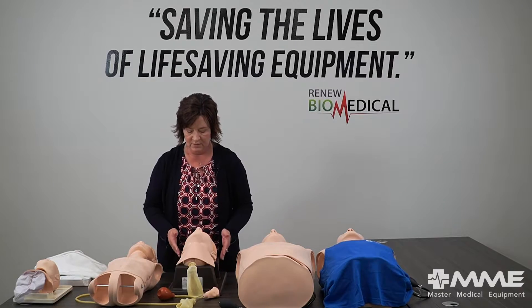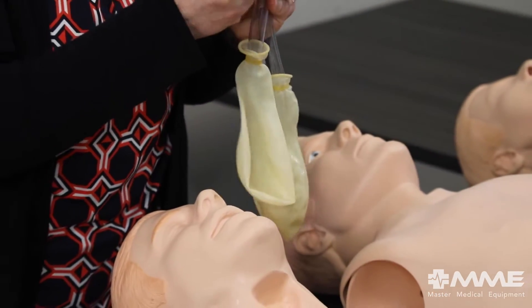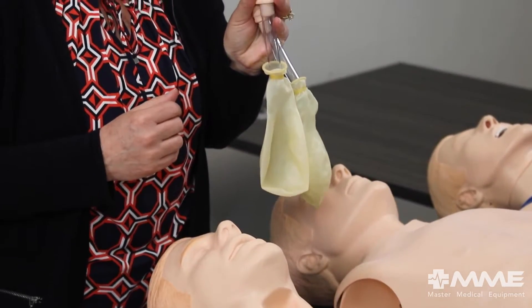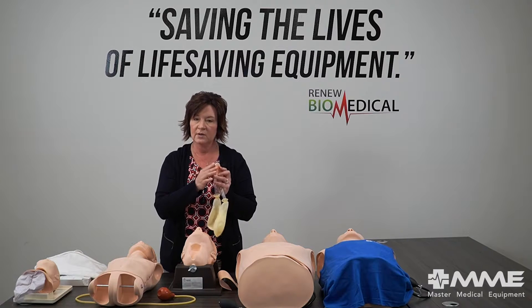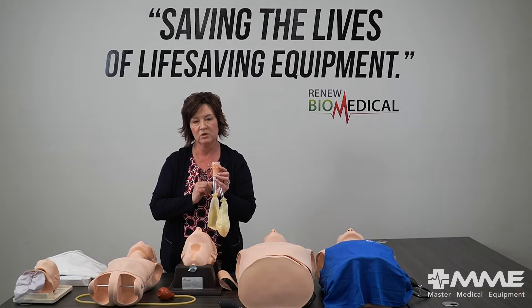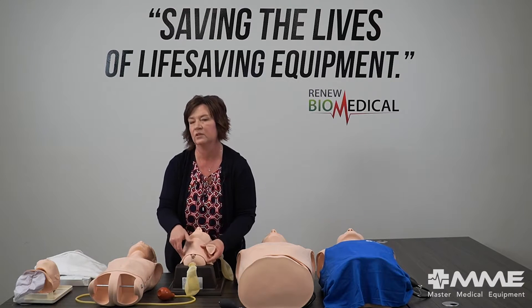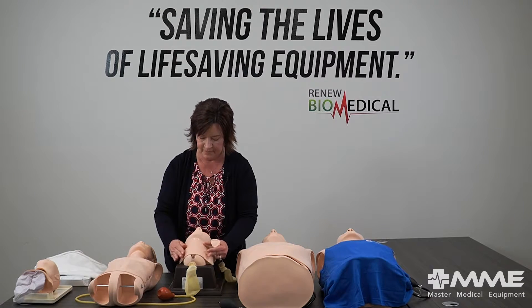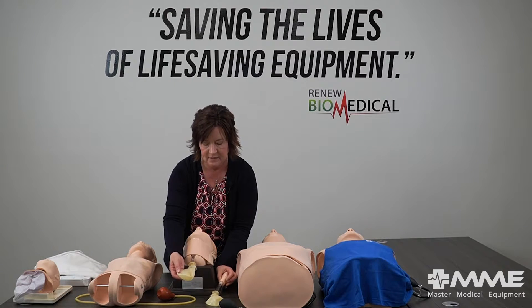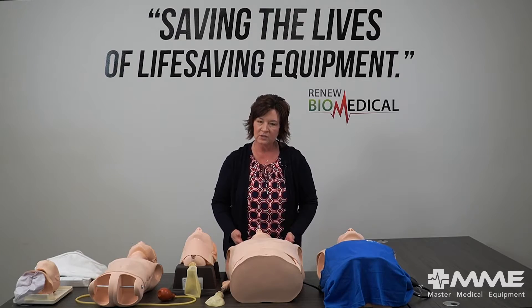I'm going to move on to the crike trainer. This model has both a soft trachea and a rigid trachea. I've covered the rigid one with what we call high tape. You can do a needle or surgical crike on him — if you do the needle crike, you put the high tape over the pre-ported rigid trachea, and when you puncture it with your needle through the skin you get that nice pop you'll feel during a real crike. You also have the anatomy so you can feel exactly where you're supposed to be, and once your airway adjunct is in place you can bag it and get inflation.